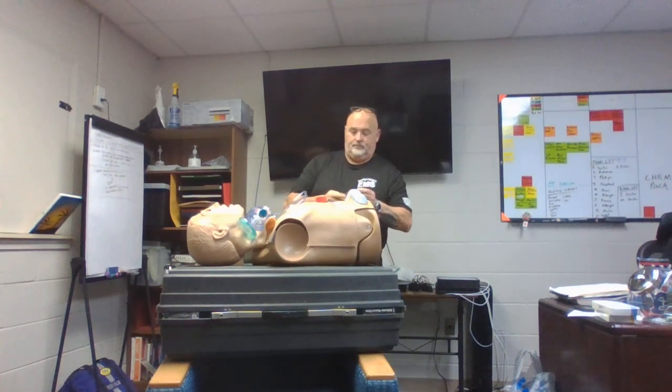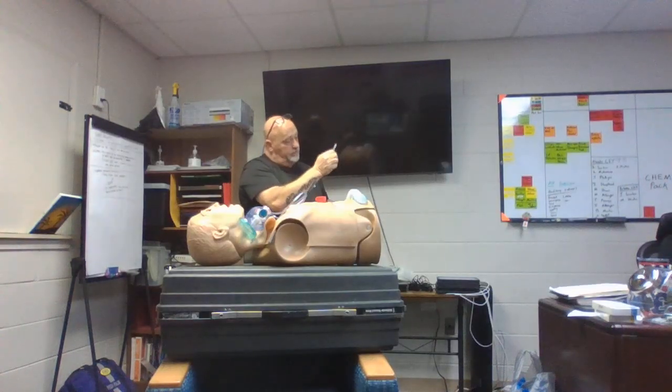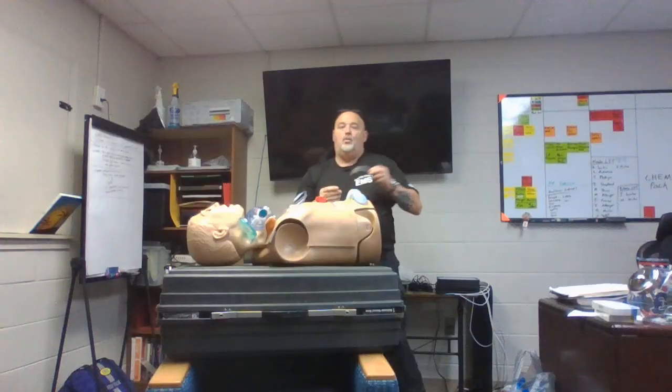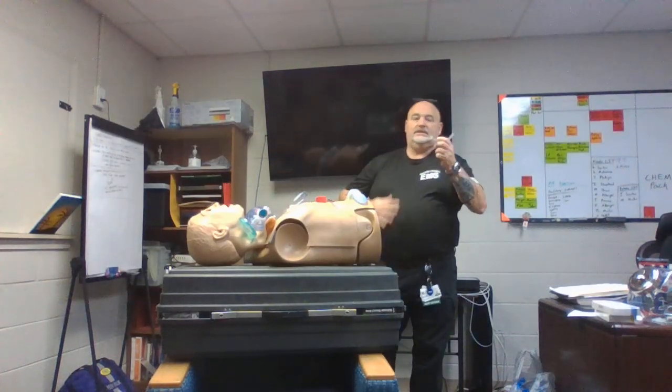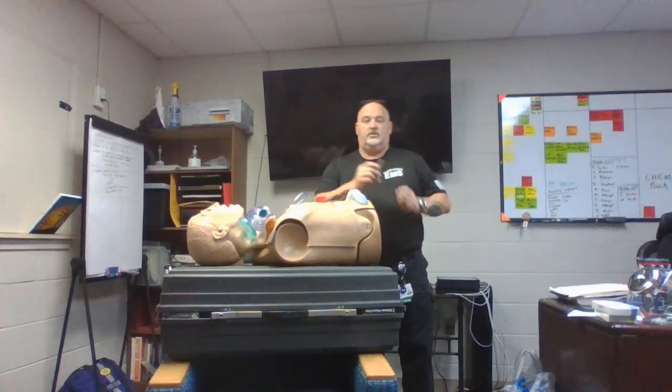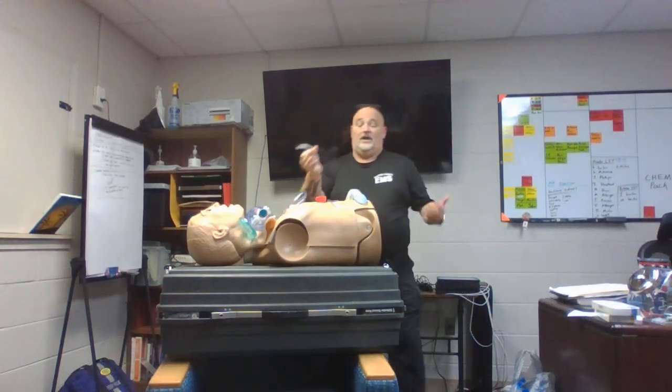Lube it up. Justin, bevel towards the nose or away from the nose? Towards the septum. Smart. Why? Because it's part of our contraindication, correct? We do not put these in for the patient who has suspected head trauma. Why?